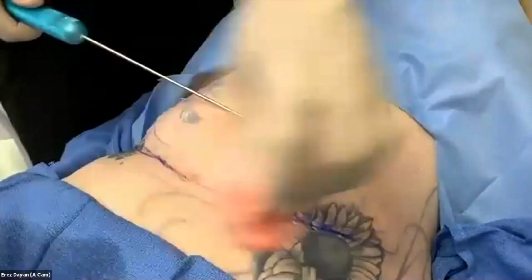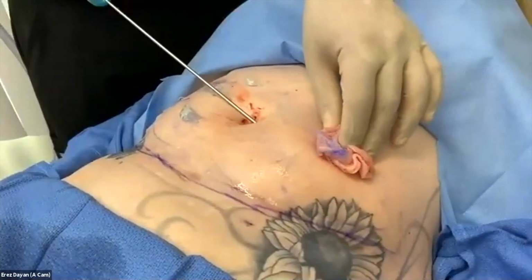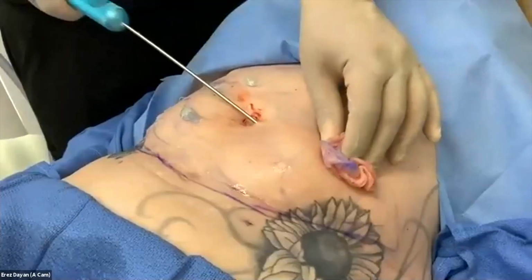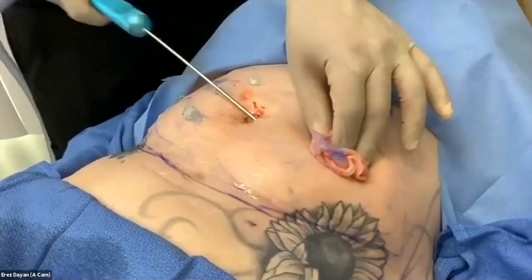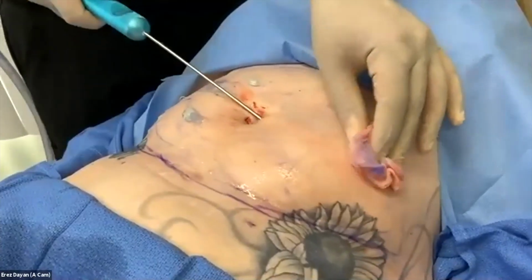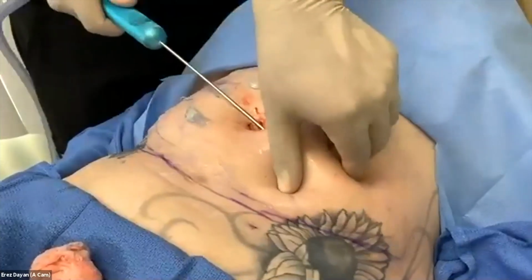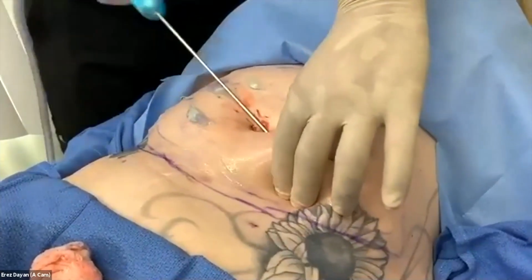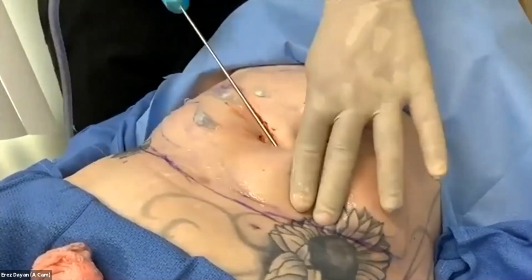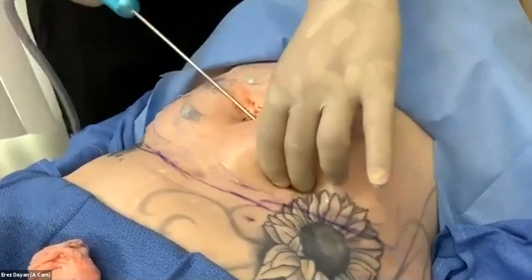So I think the key thing is just use a lot of tumescent. Use a large cannula for tumescent, so you really make sure you're spreading it and you're breaking through scar tissue. The cannula on the body tight and face tight is strong, but it is flexible. And I haven't had an issue of misguidance into fascia, but you do want to make sure it has a clear path for sure. So that's just something to consider. But I've done it on patients that have had X-laps. I've had it on patients with many previous operations. So it's not a contraindication. So let me just do a little more lipo on this side.